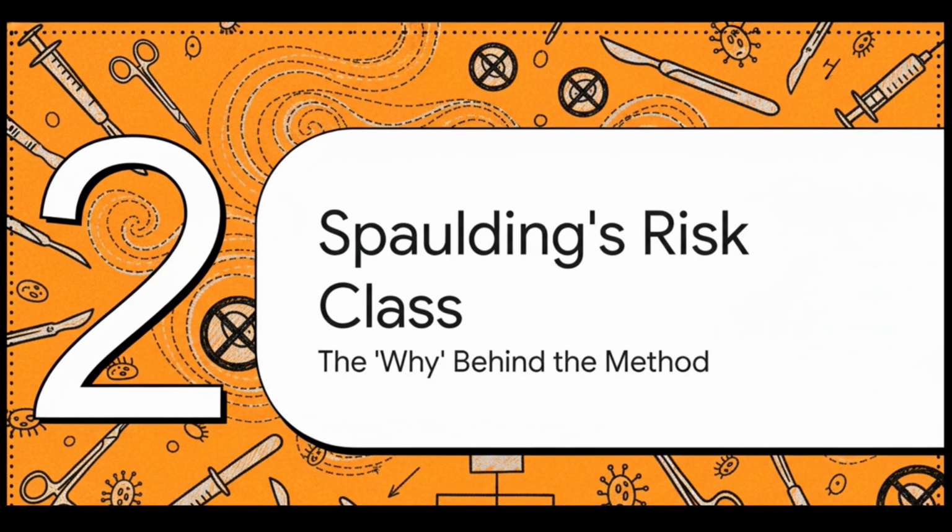Okay, now we know what these processes are, but how do we decide which one to use for a specific instrument? Do we sterilize a stethoscope? Do we just disinfect a scalpel? No way. And the reason why is Dr. Earl Spaulding's brilliant classification system. It gives us the logic for every decision we make.